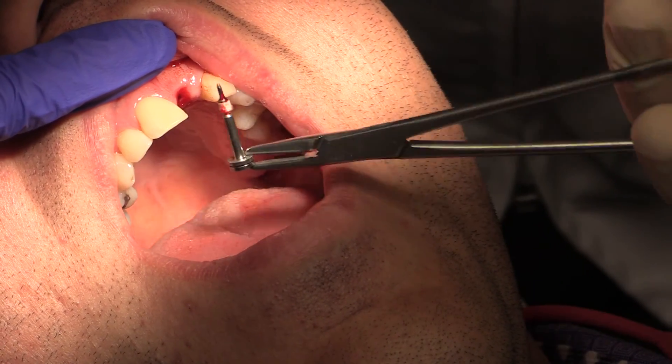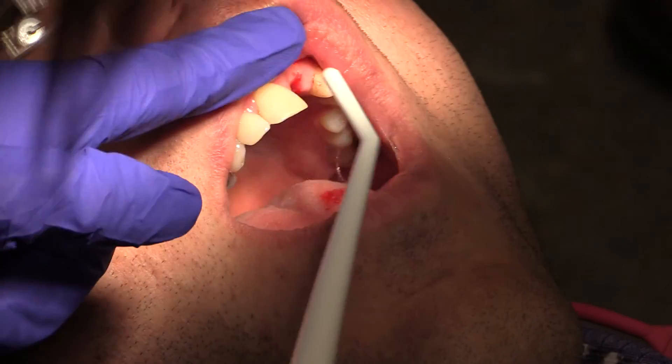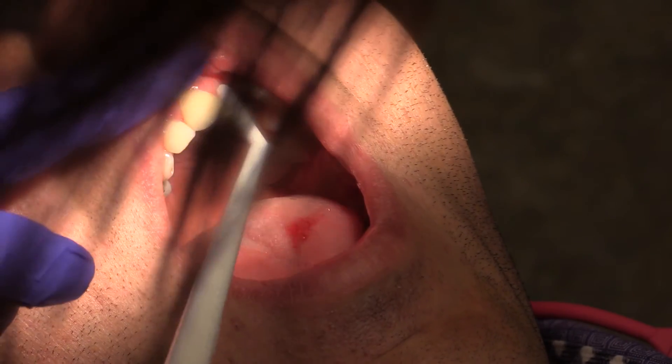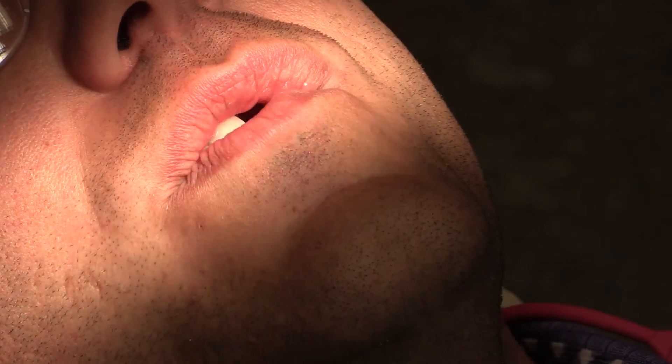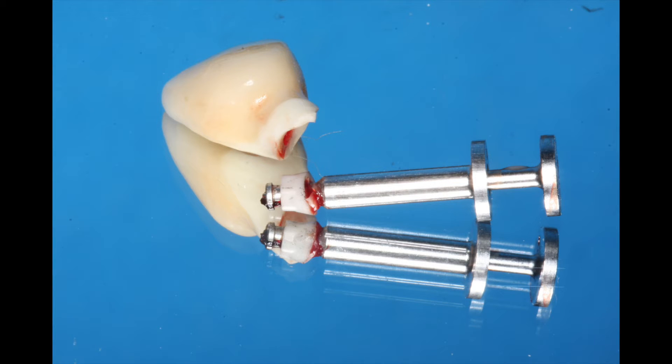The patient was surprised that it came out so easily — in fact, he had been told it was going to take a little bit longer, so he was quite happy with how easy the procedure was. As you look at these pieces, you'll notice this was probably a heel jam, where part of the abutment jammed in and the screw was pinching sideways on the abutment.